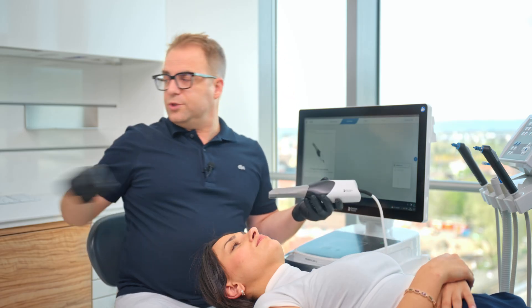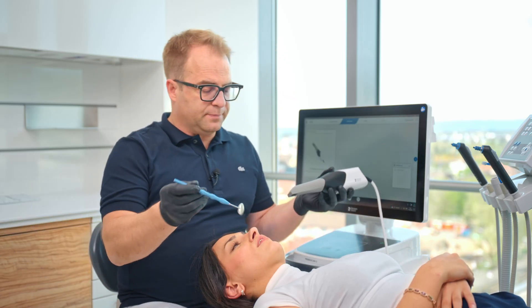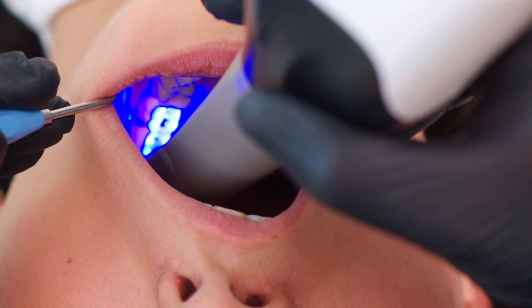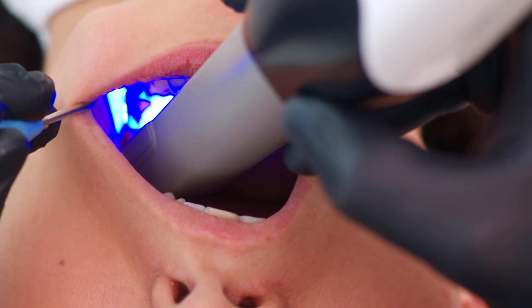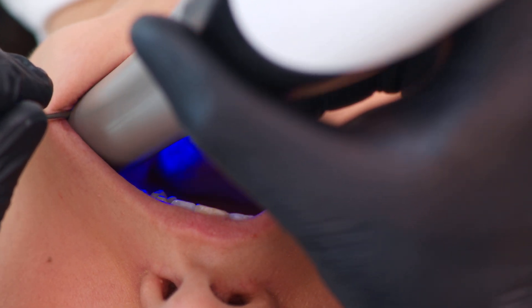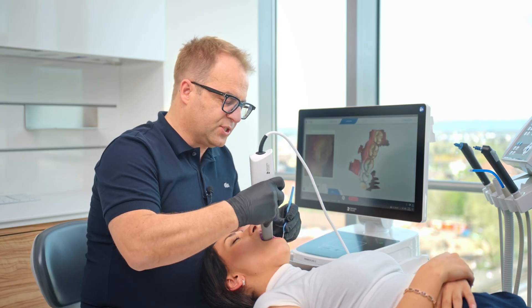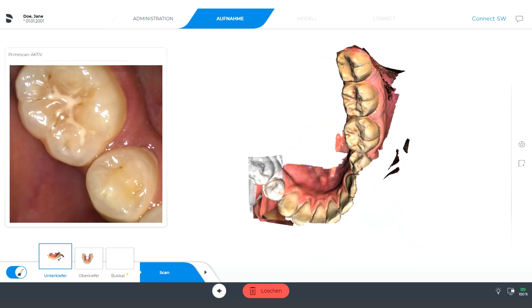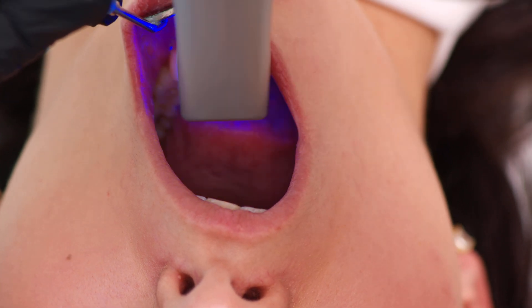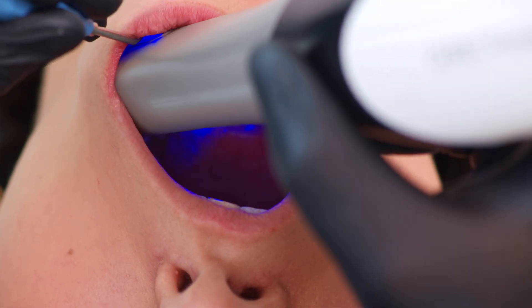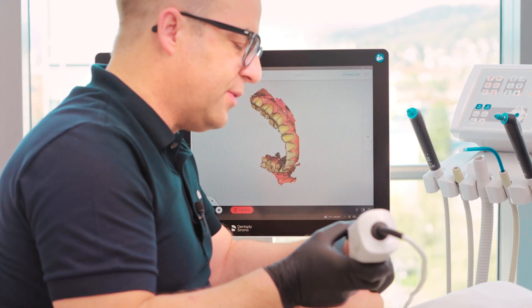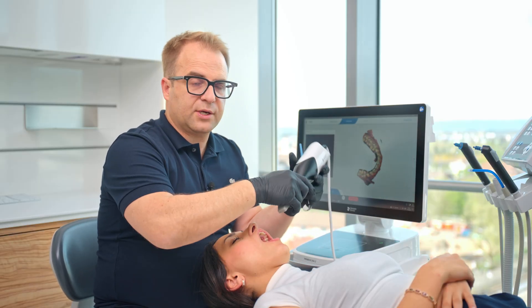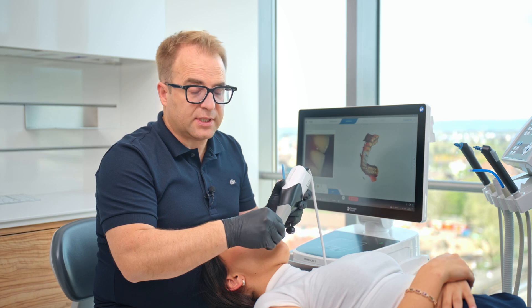Now the lower jaw. For the lower jaw I will need a mirror to help get enough space between the tongue and the cheek. There are different scan strategies — of course you can start with the palatal or lingual side, then the occlusal — and these can be altered to your individual needs. Remember, there are slight differences in results, but overall a good scanner will always create accurate scans.